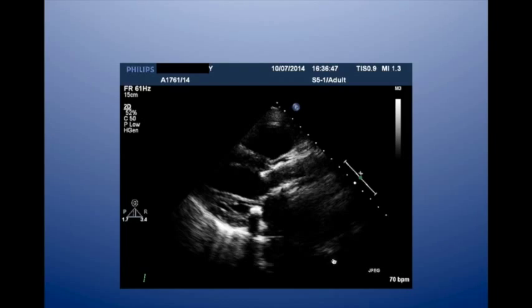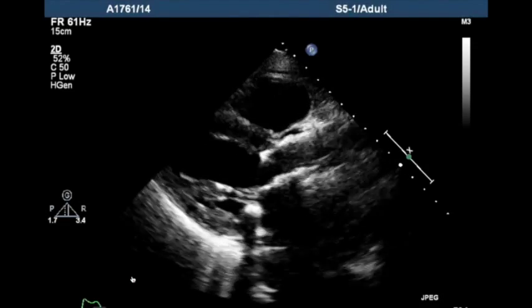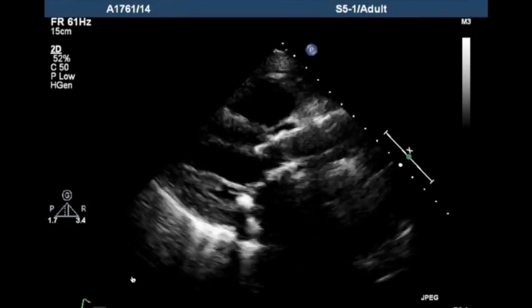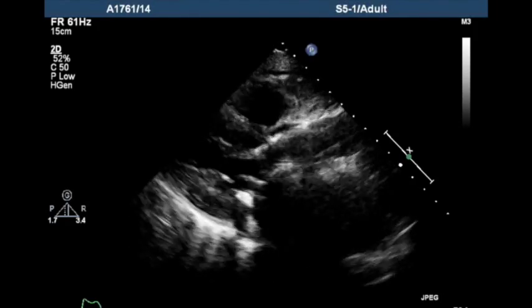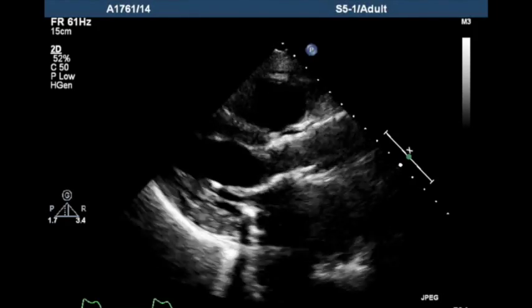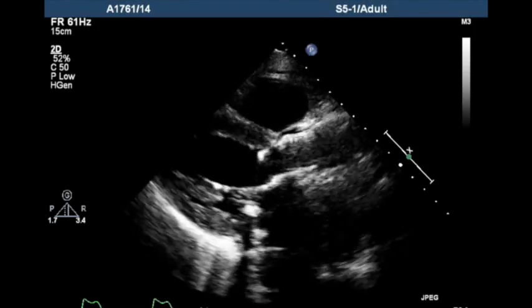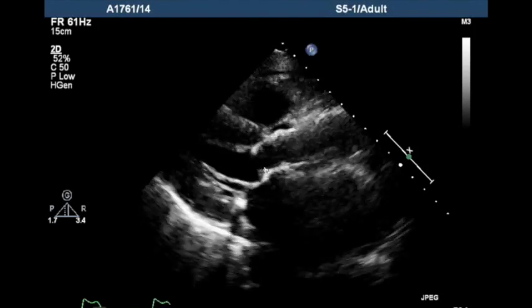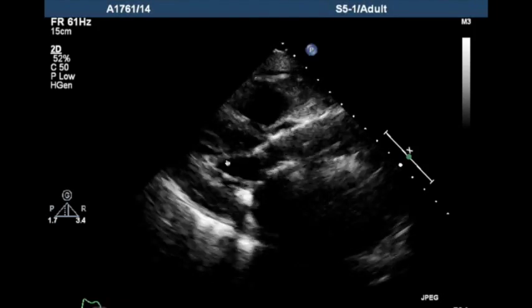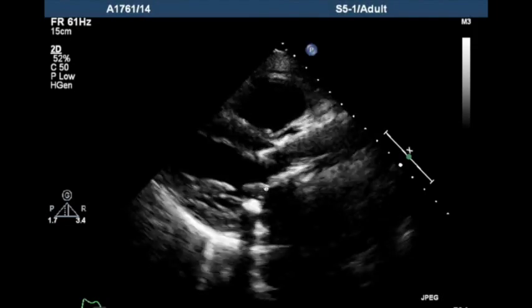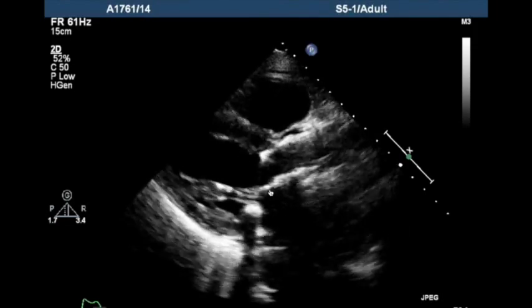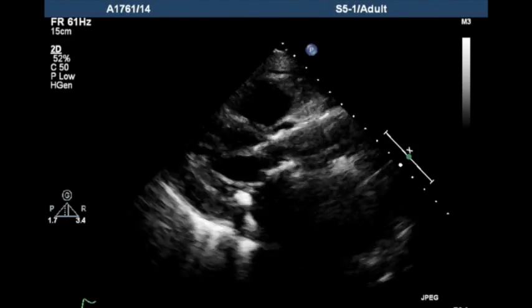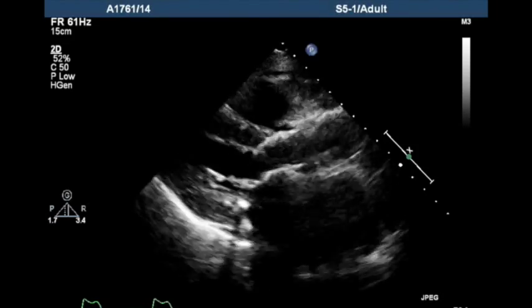The next day: LV function is good. You can see this was a particularly deep implant — we are well into the LVOT. This is where you can interfere with the anterior mitral leaflets too, if you're too far in. Not so much with the straight Portico valve, but if you've got a flared valve, you'll impede anterior leaflet movement if you go past the hinge point, potentially causing acute or gradual mitral regurgitation, since self-expanding valves continue to expand progressively over the days after the procedure.